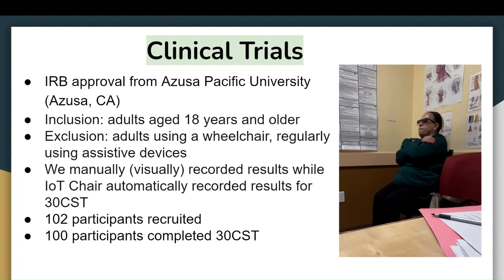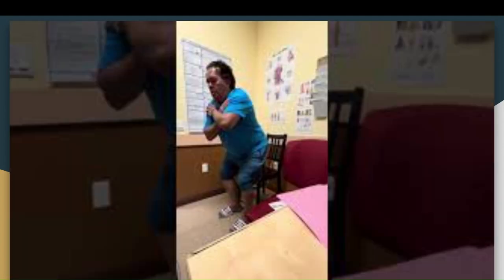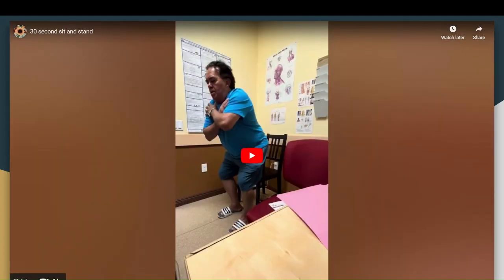How this clinical test worked is that we manually recorded the results, which is the more traditional method, while the IoT chair automatically recorded the results for the 30-second test, allowing us to compare the two results. We had 102 participants recruited, with 100 participants completing the 30-second test. And here's a little video demonstration of one of these patient trials.